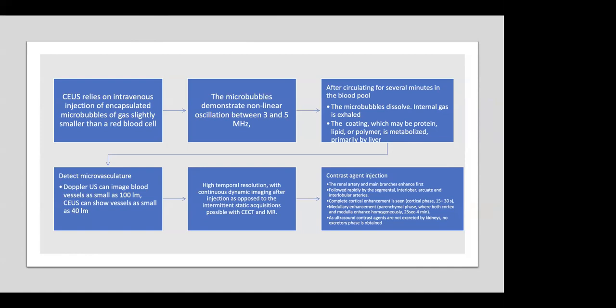The only limitation is that the field of view is a focused area, so we cannot use it for the purpose of staging, which is one important requirement whenever we are looking at tumors. So the rest you have described very well, I think.